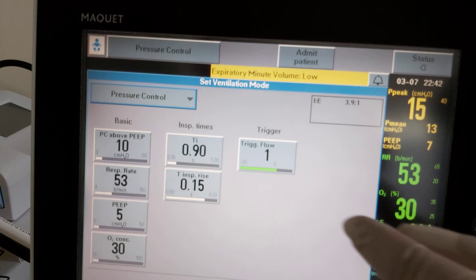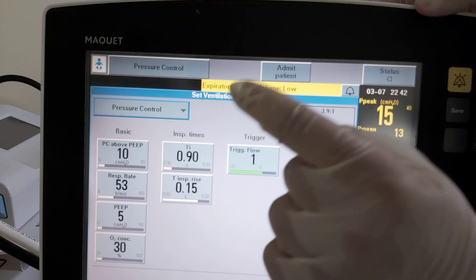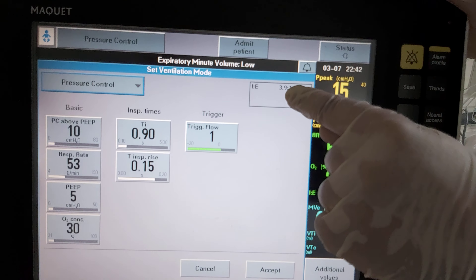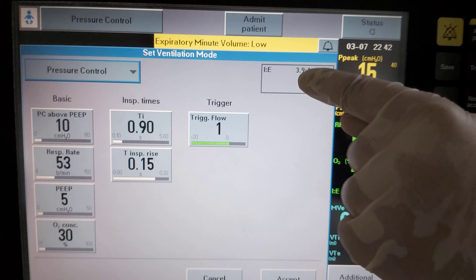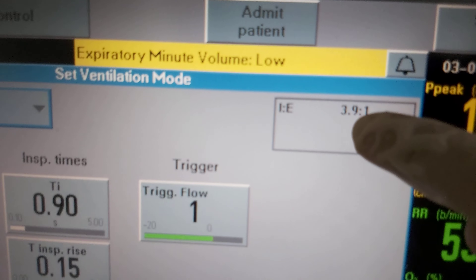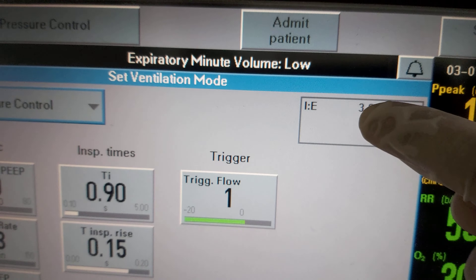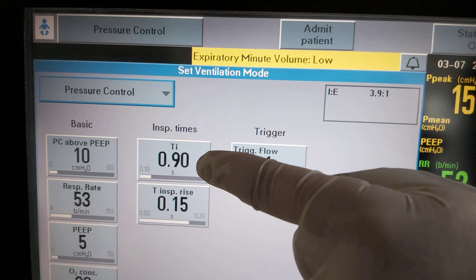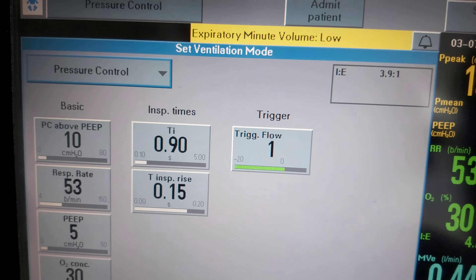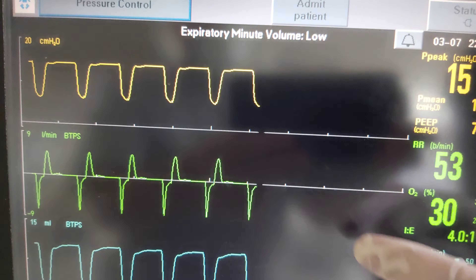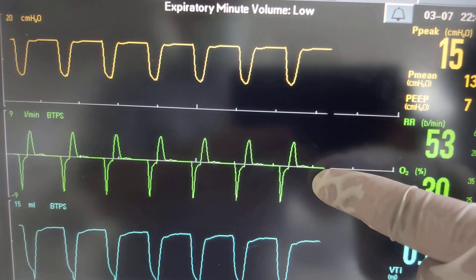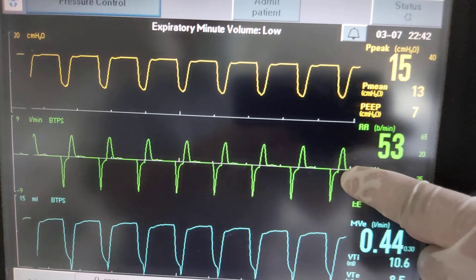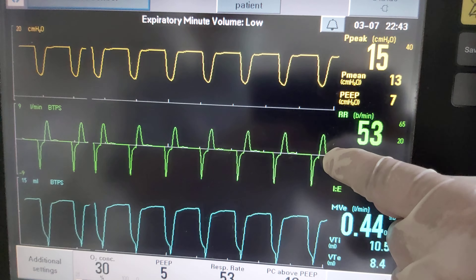Here in these settings, we have set an extrinsic cause: a wrong I:E ratio. The I:E ratio is an inverse ratio of 3.9 to 1 because the inspiratory time is too high. This created auto-PEEP or air trapping, and the exhalation is not returning to the baseline.